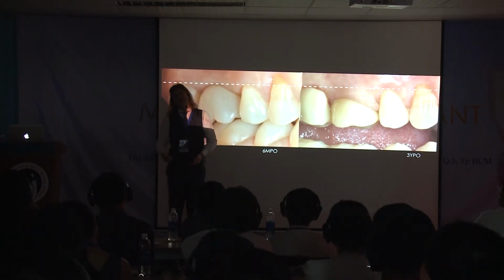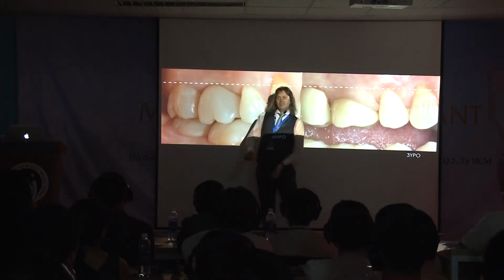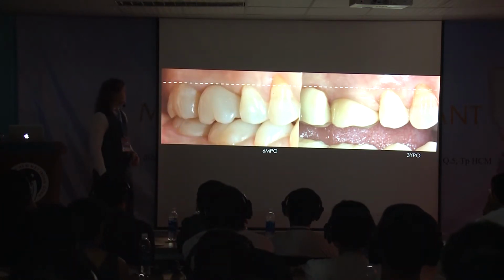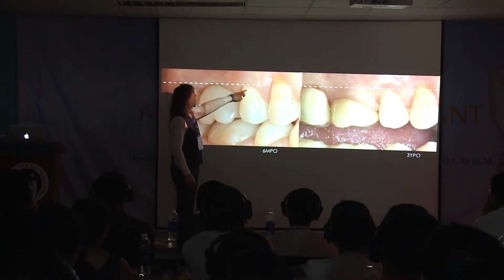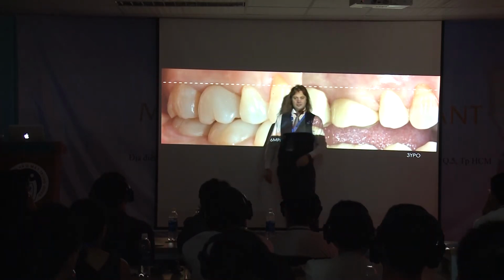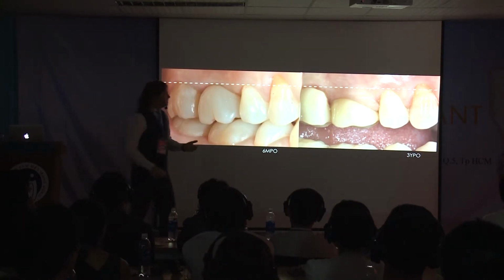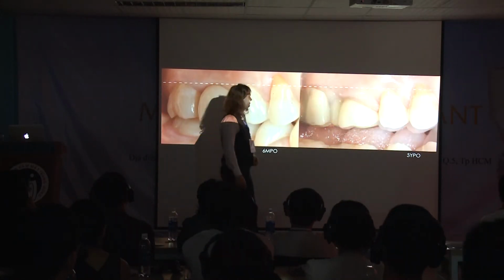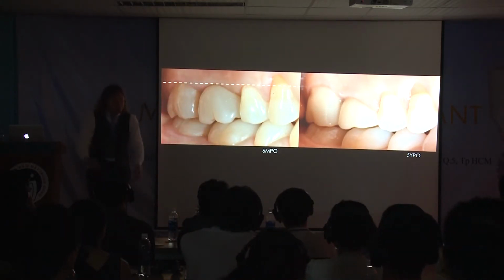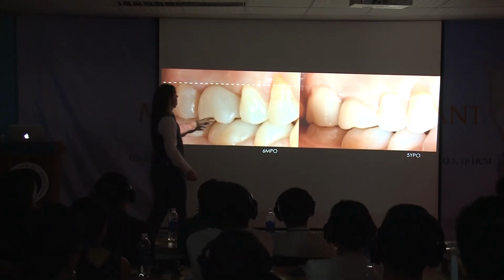Actually, there is. It's prosthodontic. If my technician increases the volume here, it pushes up. It will increase only horizontally. You see the time pass for sure. Here there's no recession. And here there is an abrasion and a recession. This lady has a recession problem, but it grows. And this is 5 years later. Even worse. This is time passing by, the truth. It's not fake timing. You see?